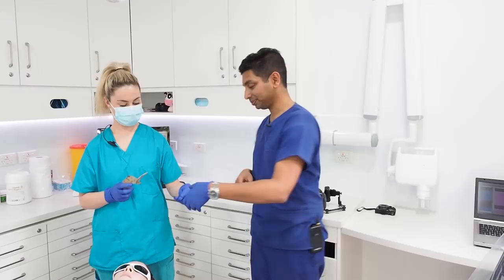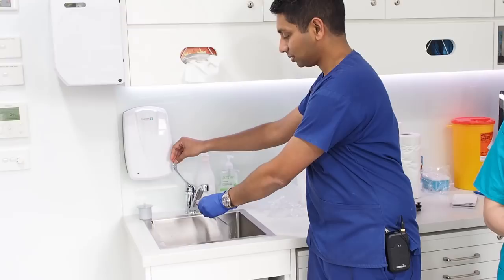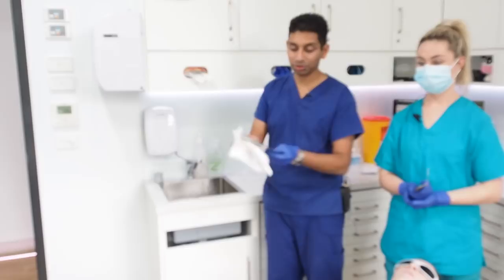The easiest way to stop fogging is to get some warm tap water and dunk the mirror in for a few seconds. If you don't want to do that, a nurse with a triplex works just as well. Or you can get your patient to stop breathing, but unless your insurance is really good, try not to do it for more than 30 seconds.